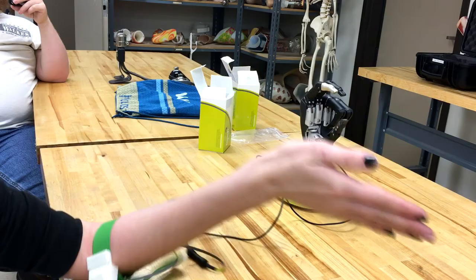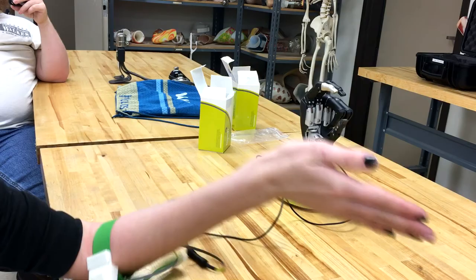You want to try throwing the switch on this? Whoa. What was that? Another movement. Yeah.